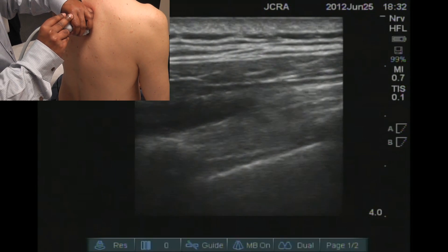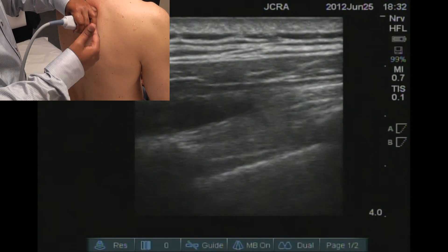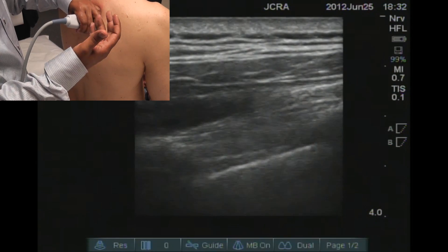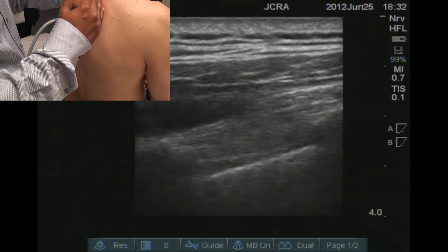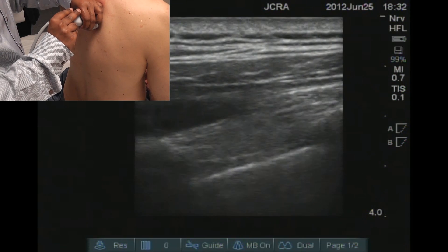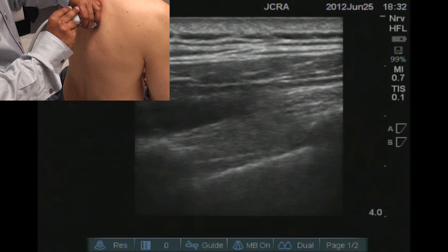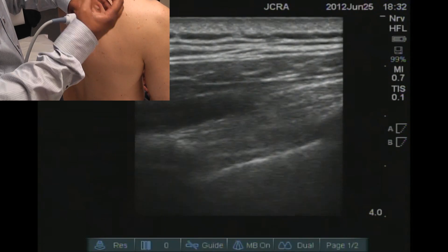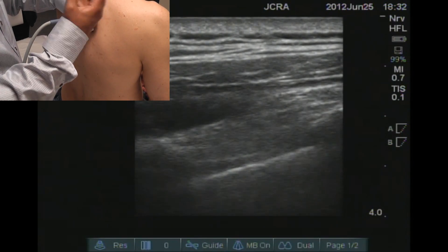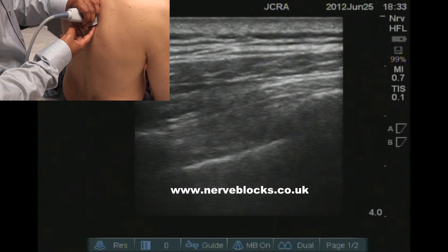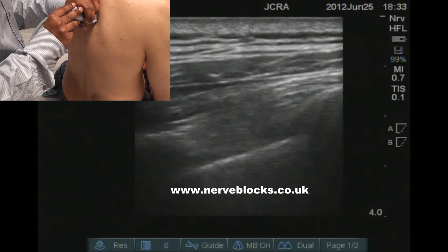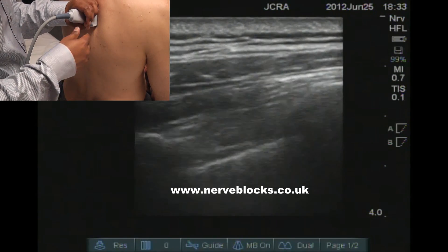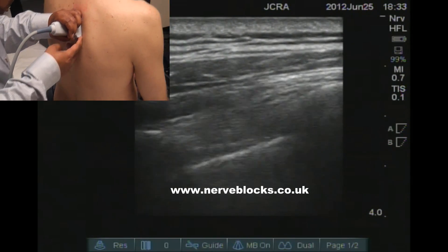Inject a small volume of local anesthetic to see whether it is in the correct space. After aspiration, if you are in the correct space you will see that the space opens up — the pleura gets pushed away. But if you are within the muscles then you will see a mostly intramuscular injection. You would need a volume of about 20 mils; you can use more than that if you want a much higher spread, usually about quarter percent ropivacaine.